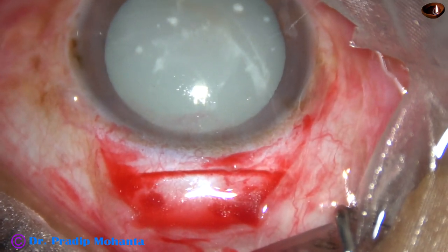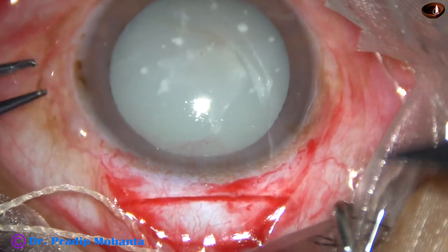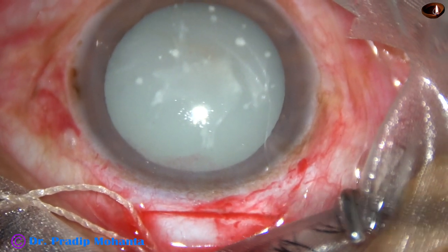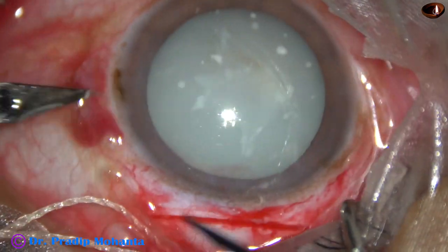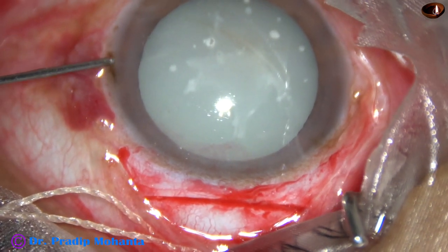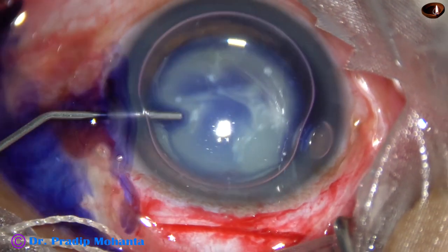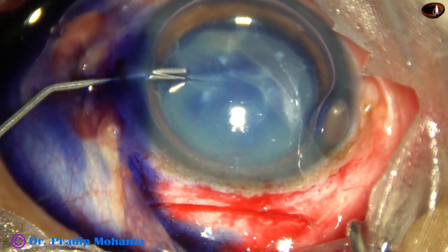Now I release the superior rectus bridal suture. I am going to make a side port at 9 o'clock and one more side port on the left side, because this may be necessary for cortical cleanup. It is not a good idea to clean cortex through the main wound, because the anterior chamber may be shallow and we can touch the corneal endothelium. So it is better to do cortical cleanup through side ports.